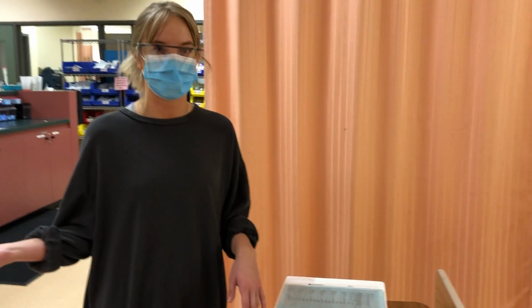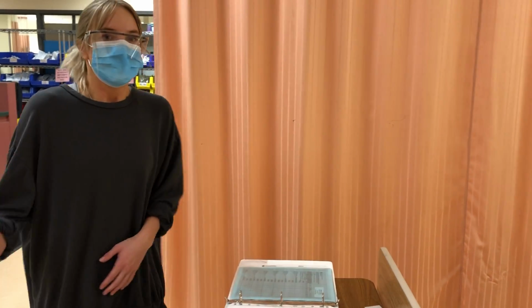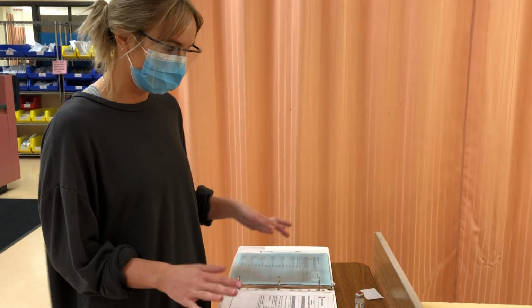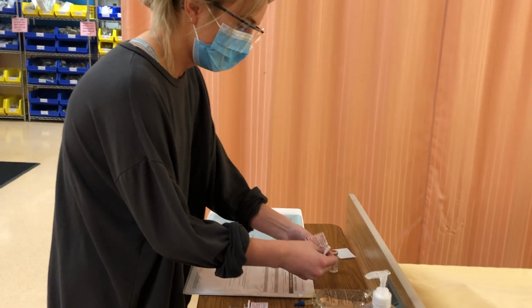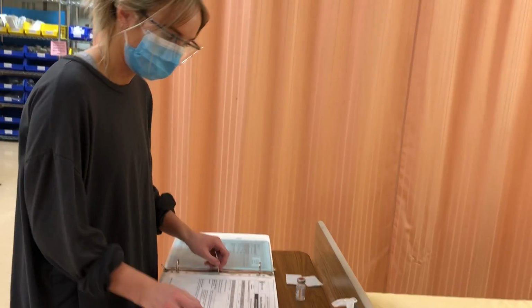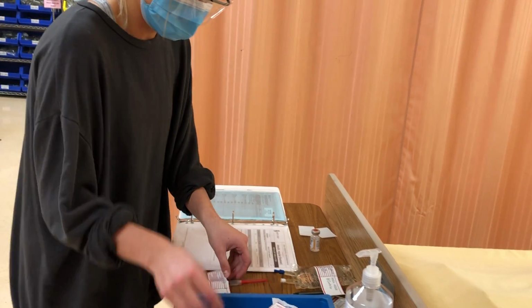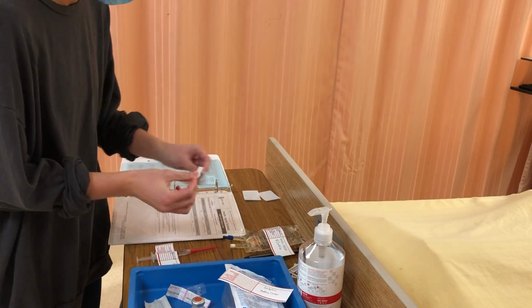So now I'm going to get a second nurse to come in and do a complete independent check. So she has come, he has looked it over, and they say it's okay. They will put a second signature on my label, and I will label my medication before I inject it. So now that the second check has been done, everything is okay, I can inject my medication into here.